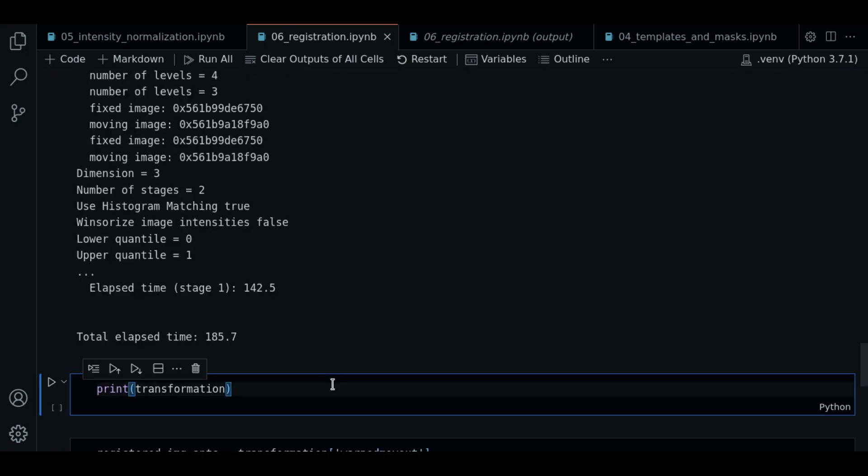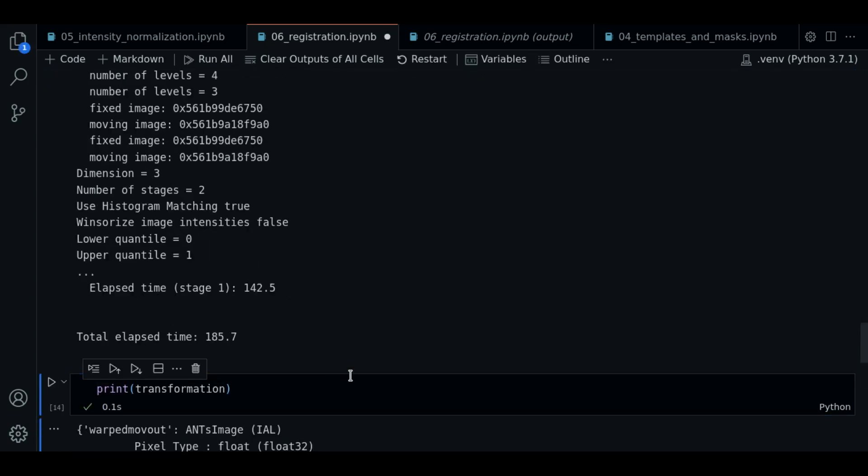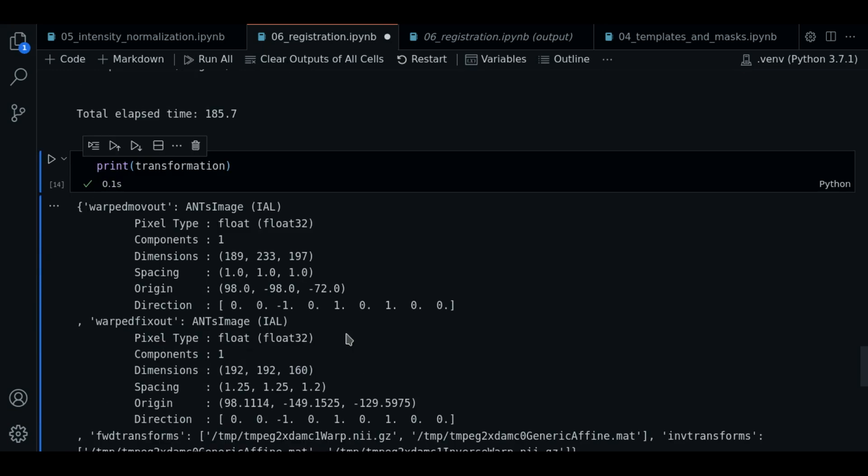So now let's print the transformation variable. In this variable, is contained the transformed image. It corresponds to the key warped_movingout.